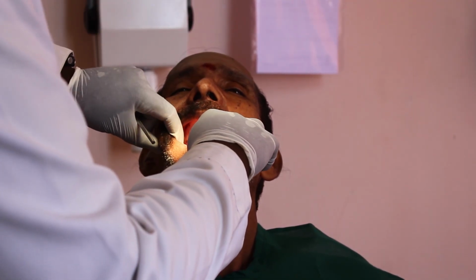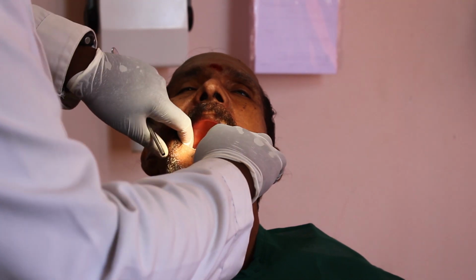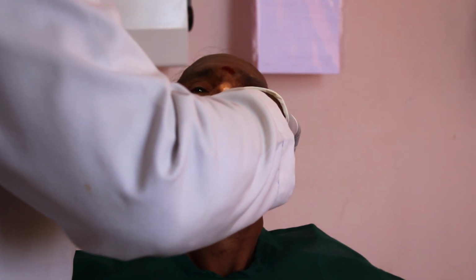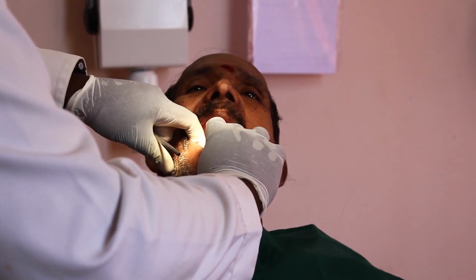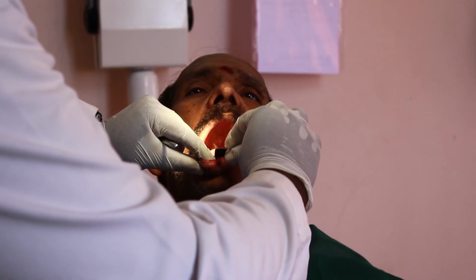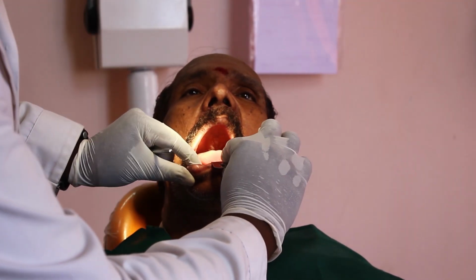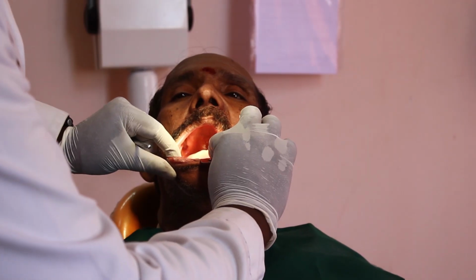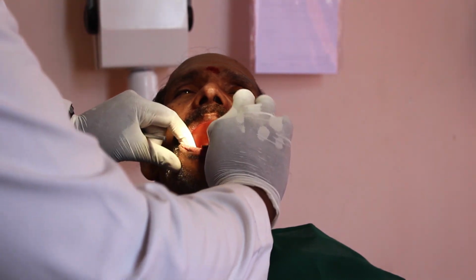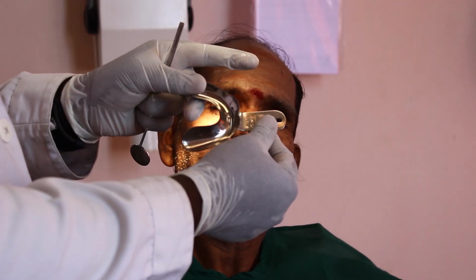After placing it, you have to see the peripheral limit. As I mentioned for the maxilla, for the mandible it has to cover the retromolar pad, buccal shelf area, and the labial and buccal vestibules, and for lingual it should cover the lingual sulcus, and also the distal lingual sulcus, extending properly without impinging on the soft tissues. And you have to slightly raise this tray, see whether it is properly seated, and reflect the soft tissue and check whether there is a 3 to 5 mm gap between the alveolar ridge and the border of the flange. So this tray is also suiting perfectly for this patient.